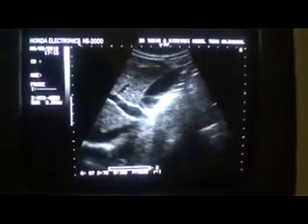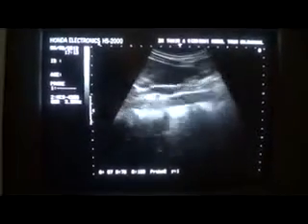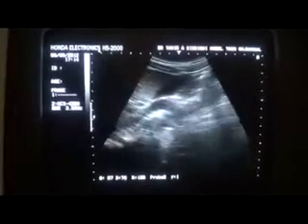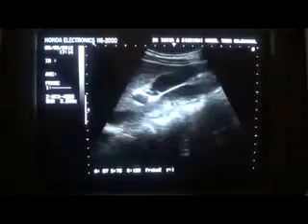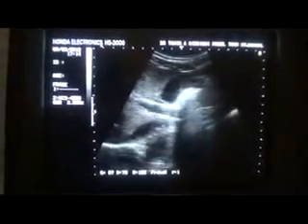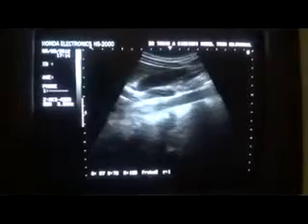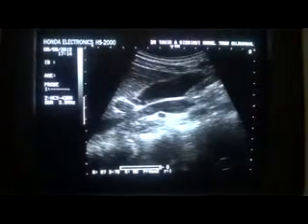Now one thing is very important: we should always see the fundus of the gallbladder. Most of the calculi are at times lodged in the fundus of the gallbladder, and as the fundus has many different shapes and many different anatomical locations that vary from patient to patient, always see the fundus of the gallbladder. Now, to see the fundus of the gallbladder, it's very easy.